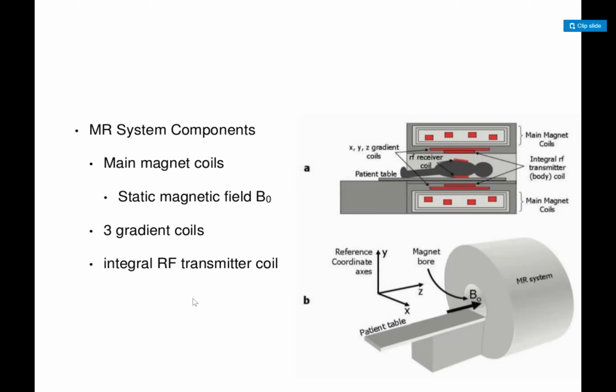So the body can be weakly magnetized, and whenever you make the body change into a magnet and you move the magnet around the body, it gives us a signal. And this is the discovery that led to MRI.